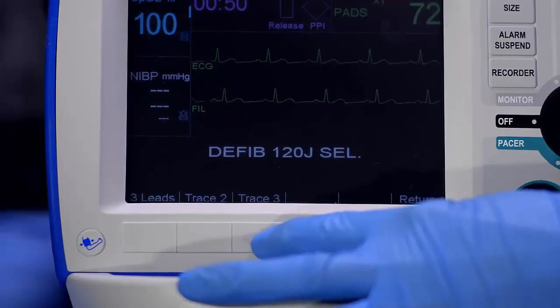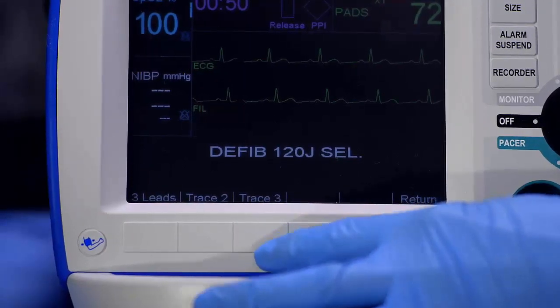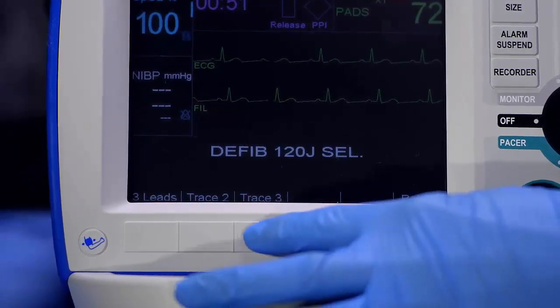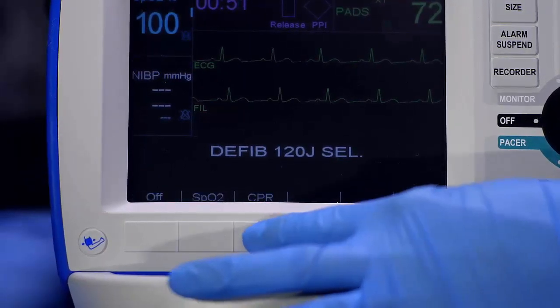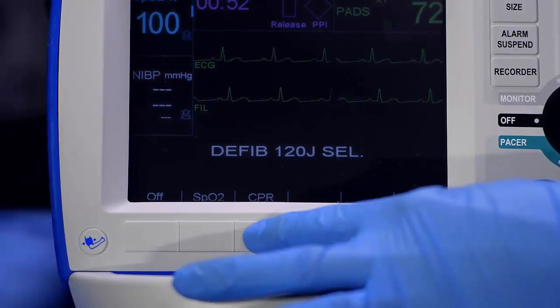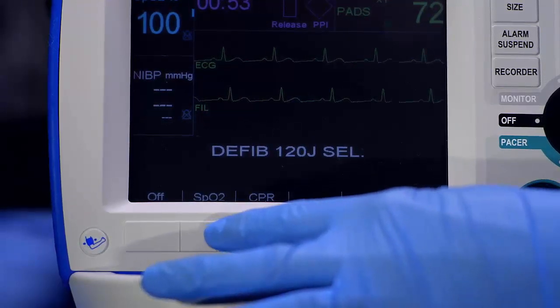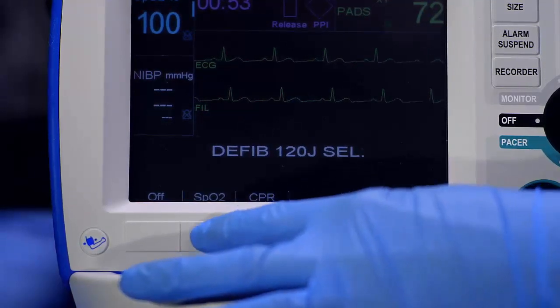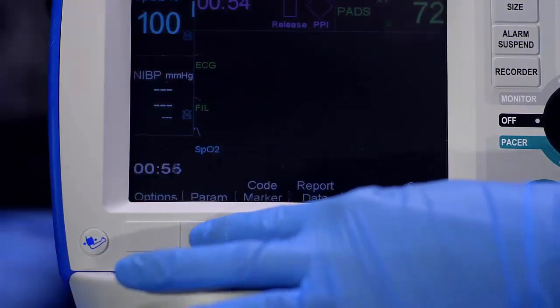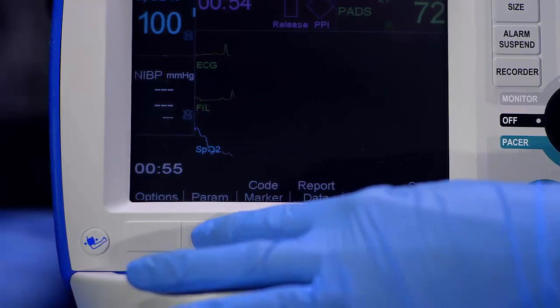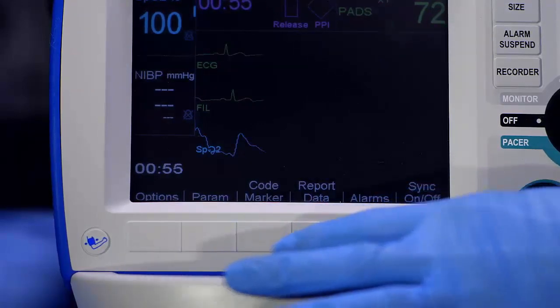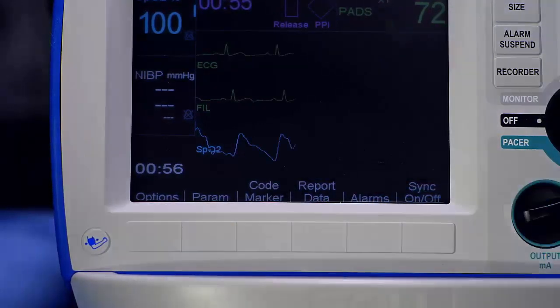The R Series screen can show as many as three traces at once. The trace for the selected ECG lead appears in Trace 1. You can press Trace 2 and/or Trace 3 to select other waveforms for display.